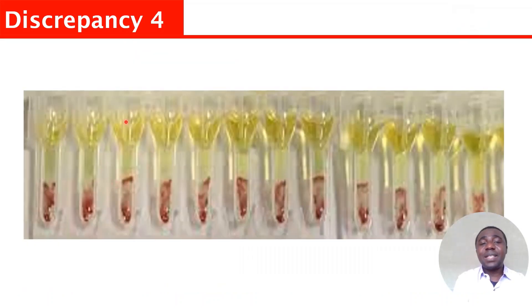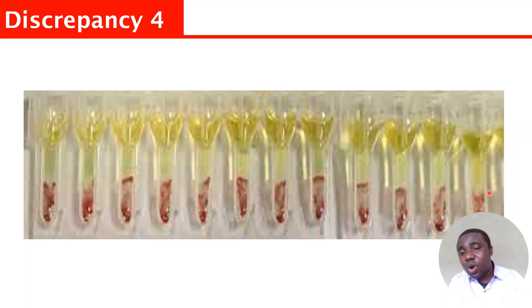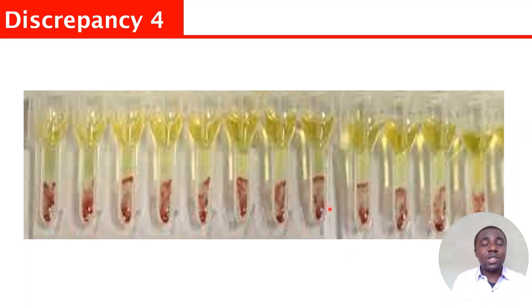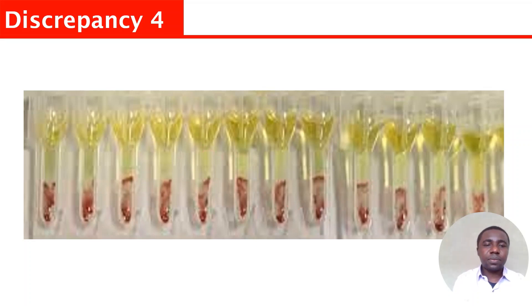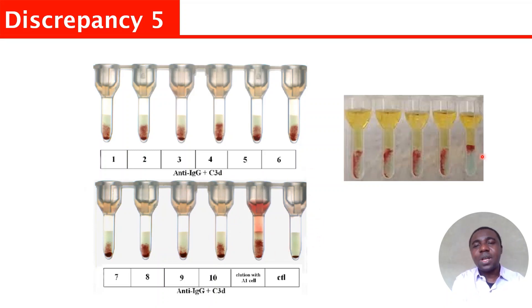Factors such as cold agglutinins, C3D complement, or daratumumab can lead to pan-reactive results in antibody screening or antibody panel. Once you see reactions throughout all wells like this, if it is not a known specific antibody in the panel, it could be due to any of those factors. In this example, the patient has C3D complement, giving a positive result in all wells. These are the things that can affect blood group and antibody screening.